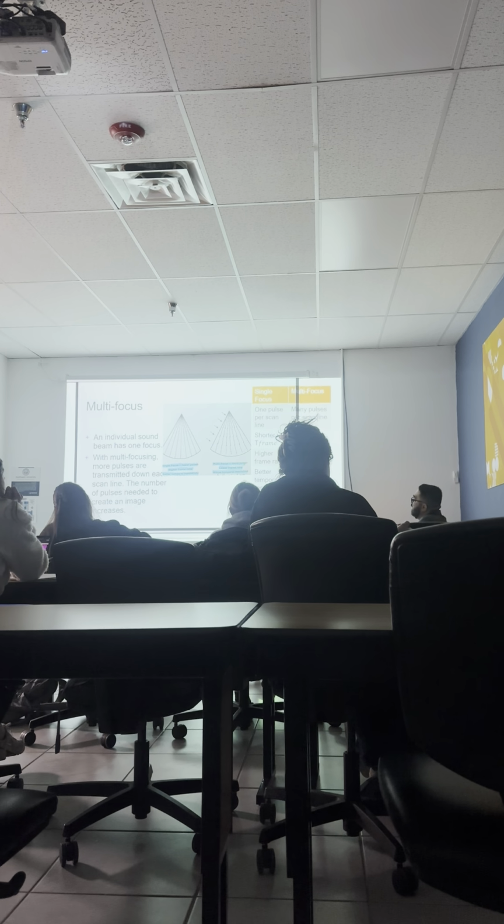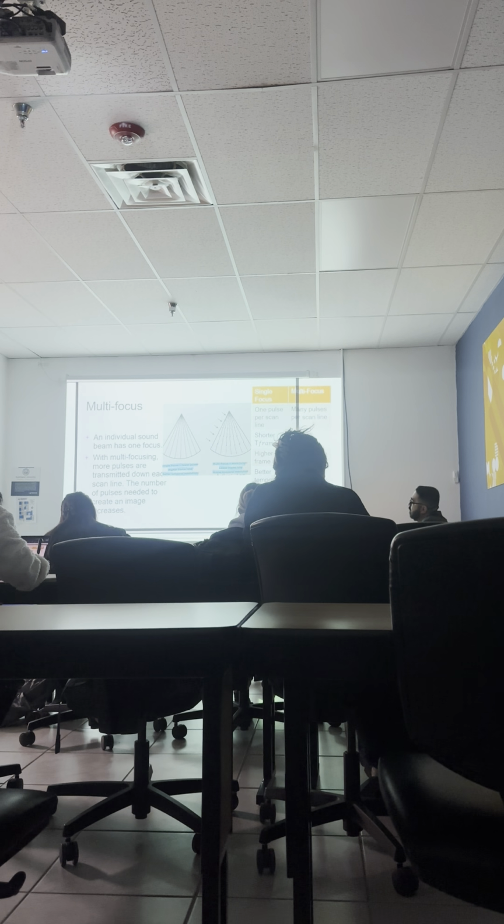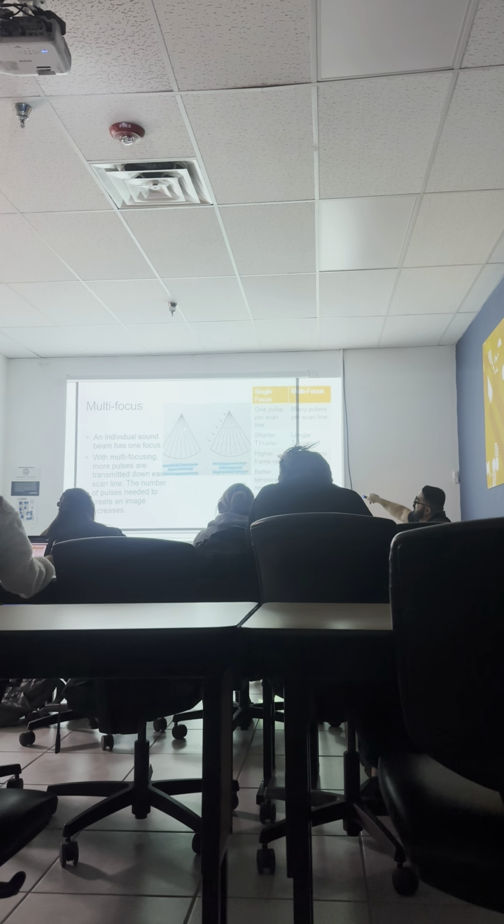Okay, multifocus. An individual sound beam has 1 focus. With multifocusing, more pulses are transmitted down each scan line. The number of pulses needed to create an image increases. So here, how many focal points are there? 1. But you see this little dot right here? Those are pulses, and all these arrows are focal points. So how many focal points do we have? 5. Okay, so how many scan lines do we have?